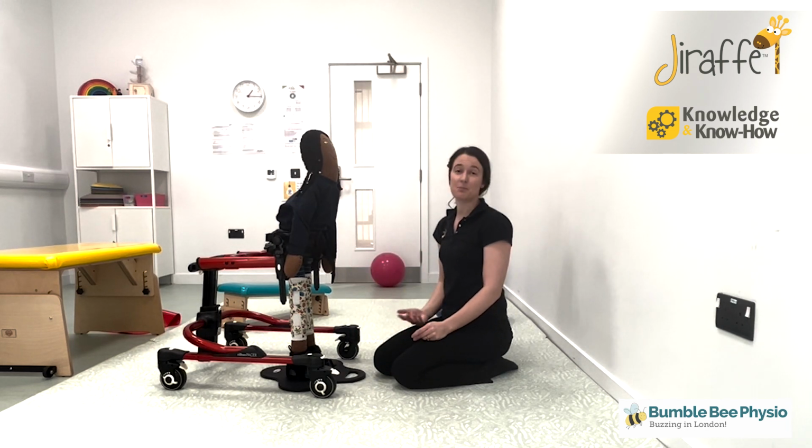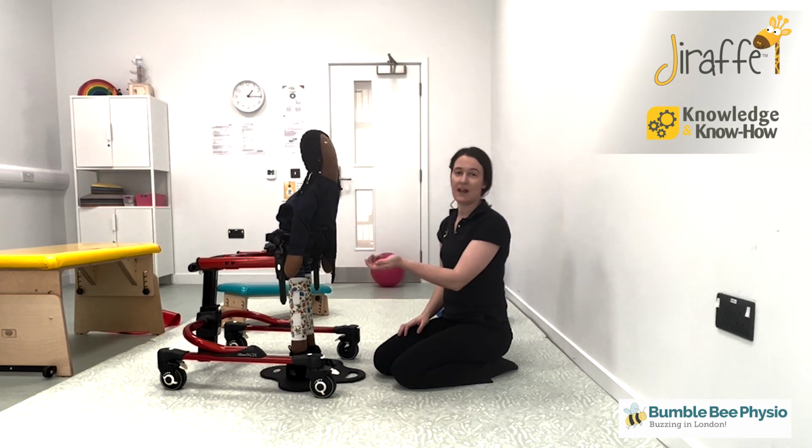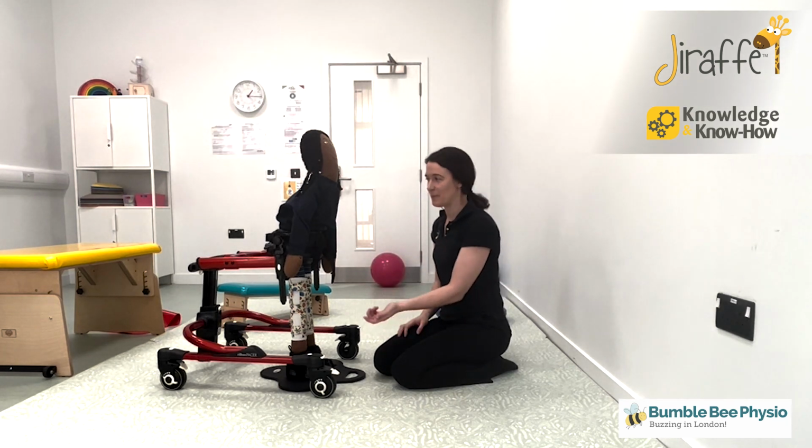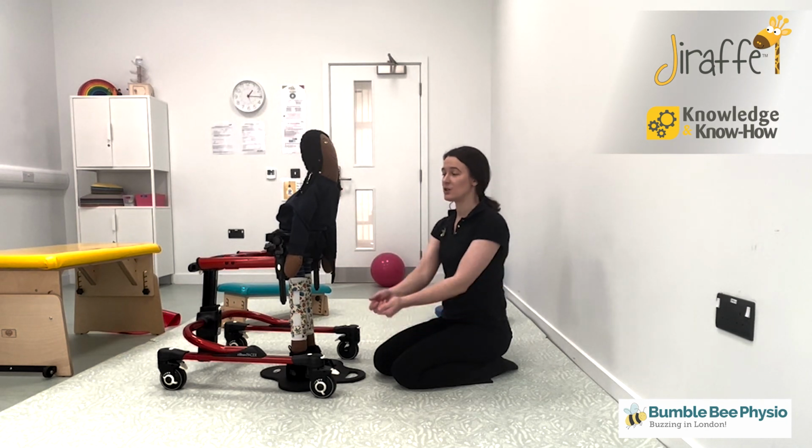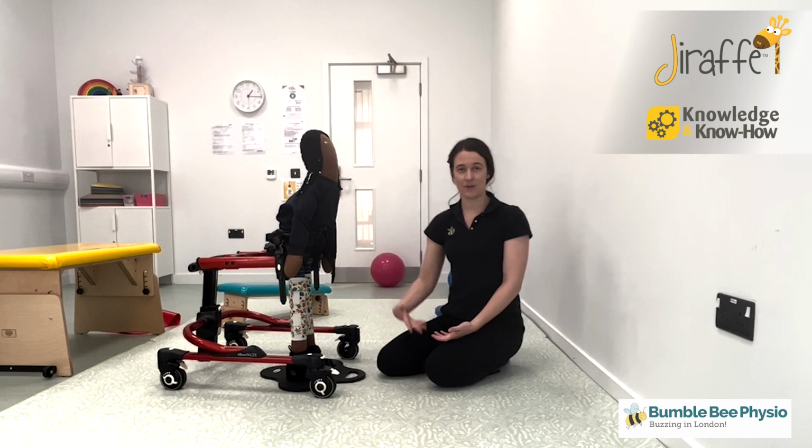So we might want to just experiment first and just see actually where can they reach to. Maybe just here, and then maybe a little bit more, and a little bit more. And then as time goes on, their hamstrings warm up, you could bring the toys further and further down and see how far they can come.